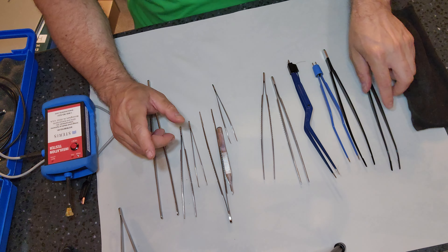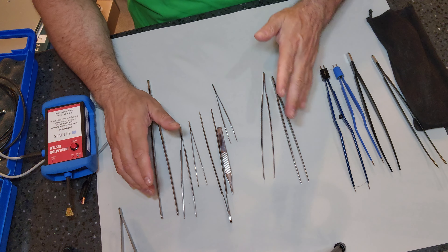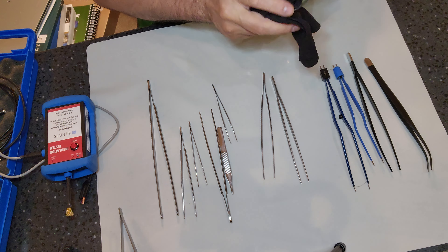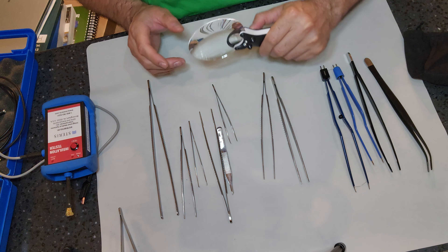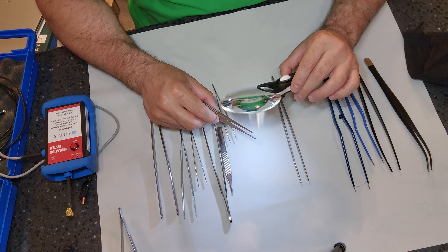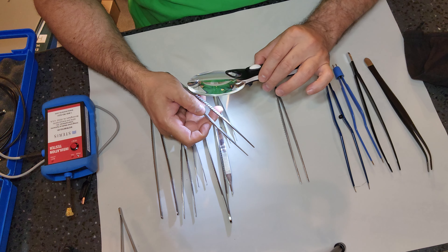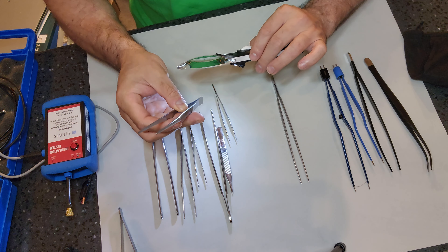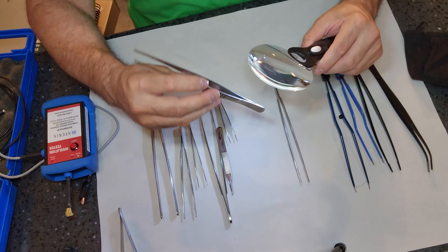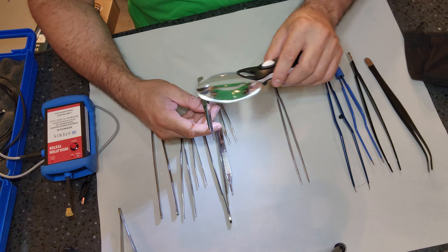We'll leave the insulated forceps to the end because that's a special group. For our stainless steel forceps, bring out your handy magnifier with light. Using light and magnification, we are concentrating on that jaw. We want to inspect for cleanliness all along the shaft of the instrument and especially at the union — you want to make sure that there are no cracks, that the crack isn't extending past there where it's almost separating, and that nothing is caked up in there hiding.